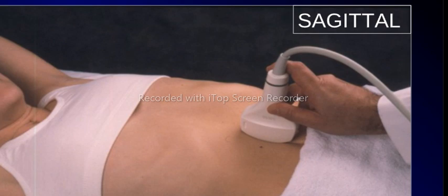Okay, so we are going to look at sagittal images first. If you still remember our orientation, any plane that is parallel to the midline is a sagittal image. If you turn your probe through 90 degrees to this side, anti-clockwise, all the images that are parallel to that plane would be axial images, regardless of where the probe is, whether it's up here, down here, or on the sides.